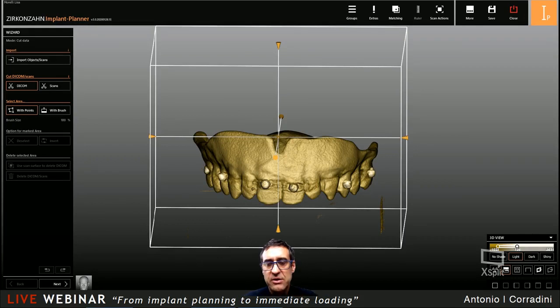And why? Because the old prosthesis or a new setup prosthesis radiographic guide can give me, first of all, the correct vertical dimension of the patient and allow me to have upper bone and lower bone related with the correct vertical dimension.